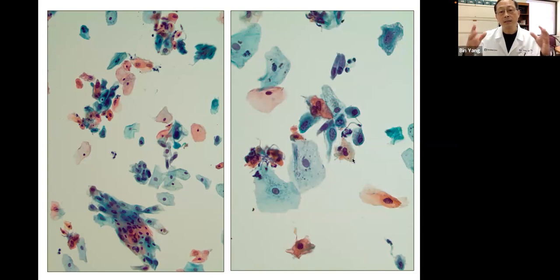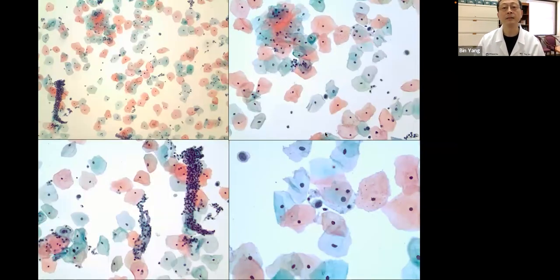So in the younger women, I see this. I will just push for ASC-H, even with few cells, because if I don't call ASC-H, this woman, even HPV positive, if you call LSIL, she will not get a biopsy. So ASCCP guidelines just repeat Pap. I feel this is higher risk. I want to dictate the course. I would like this young lady to get a biopsy.